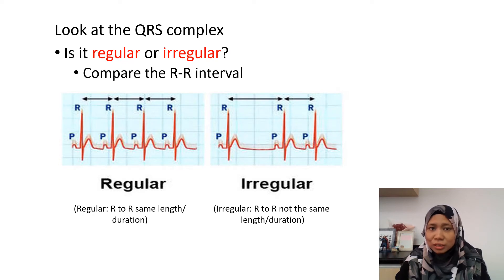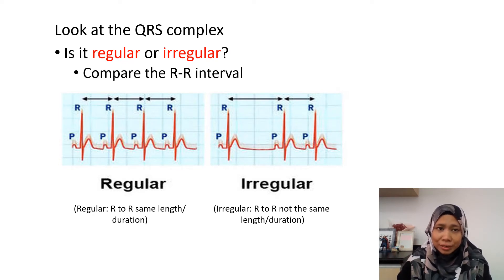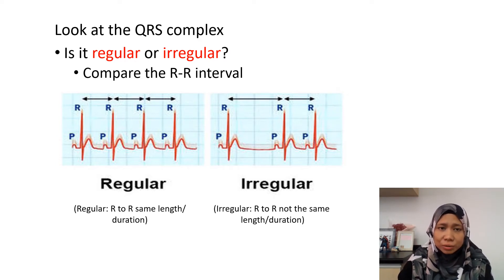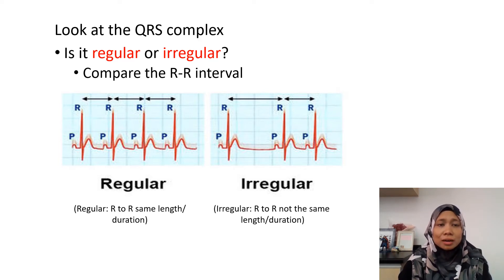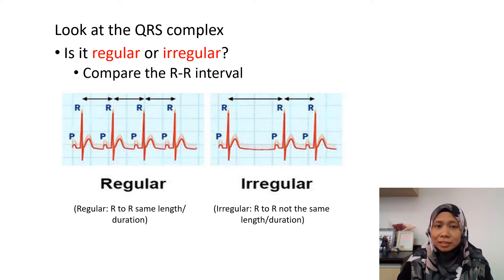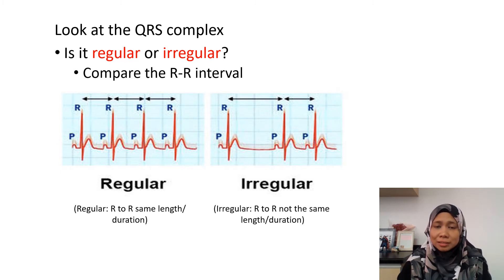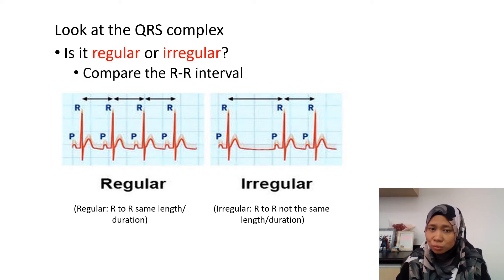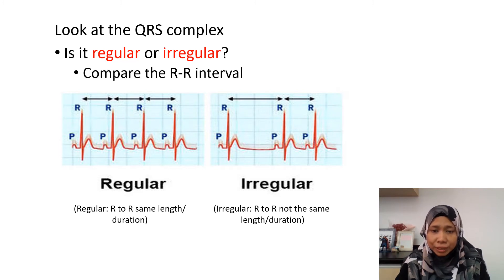We need to estimate the heart rate by looking at the ECG strip and determining whether it is regular or irregular by comparing the RR intervals. On the first ECG strip, the RR interval is regular — from one R to the next R, the distance is the same, so this is a regular rhythm. On the second ECG strip on the right side, the RR from the first R to the second R compared to the second R to the third R is not the same, so this is an irregular rhythm.